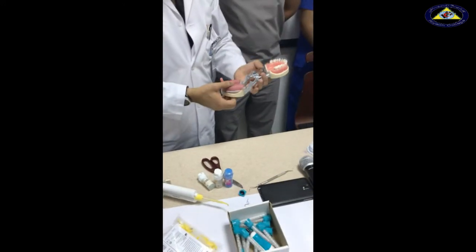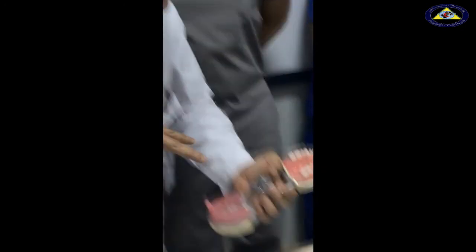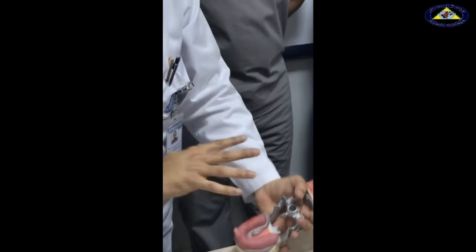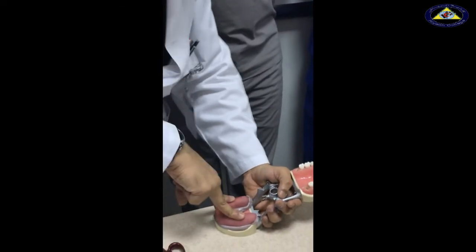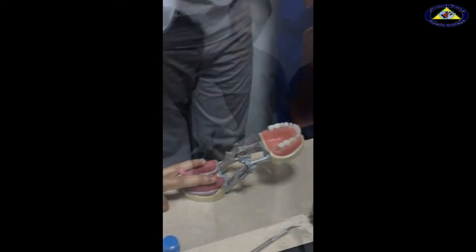We have a seating pressure and a holding pressure. The seating pressure is while I was pressing the tray into its final seated position. After I reach the seated position, I don't have to keep pressing it — there's no point. I just need to hold it, and you're going to hold it till the material sets.